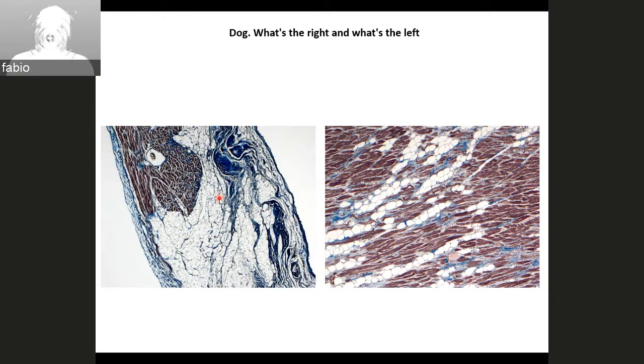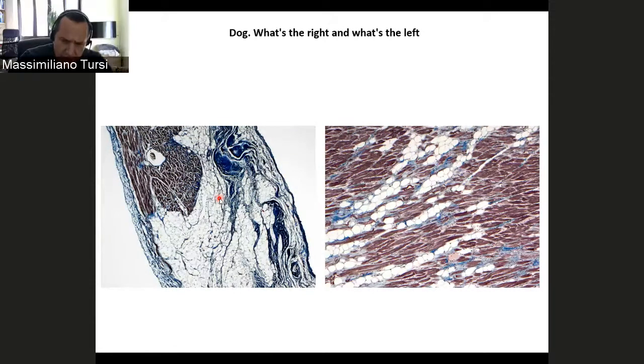Do you remember there is a type of boxer, a type of Doberman? I thought that in this type you also have fibrofatty infiltration on top of the wavy fiber, but no, it's just fibrofatty infiltration. That's interesting. In my experience, I don't have a lot of cases of DCM in dog. I have many more cases of hypertrophic cardiomyopathy in cat.